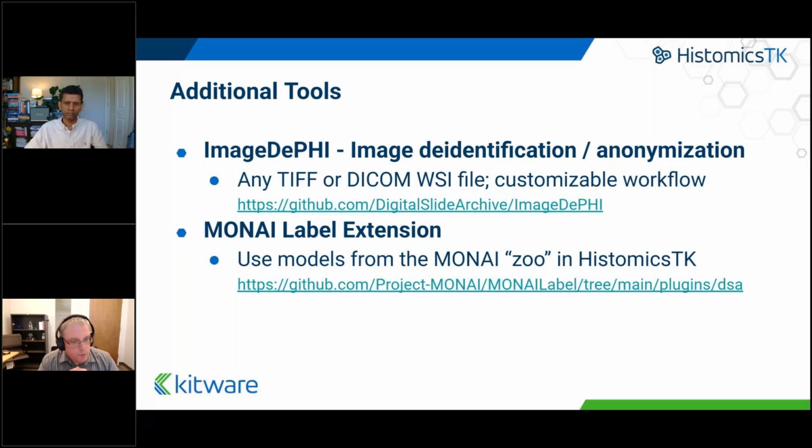There's more information, we'll share these slides and you'll have that link, but basically you can have a TIFF file where certain tools will seemingly hide that it has certain PHI, but don't actually fully remove it. And you want to guarantee that you've removed the PHI before you share it, because you don't want to accidentally leak anything with PHI.